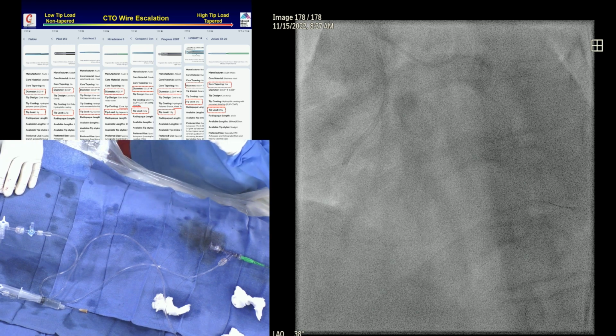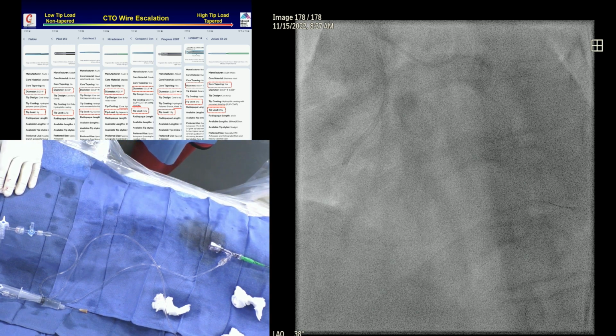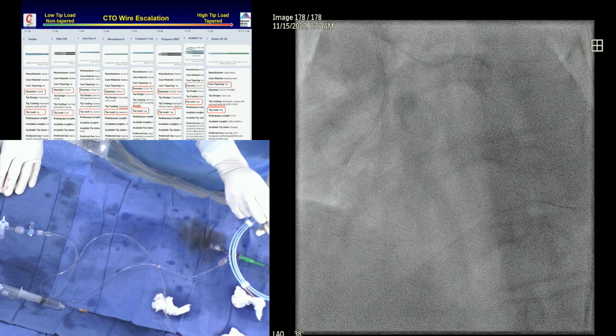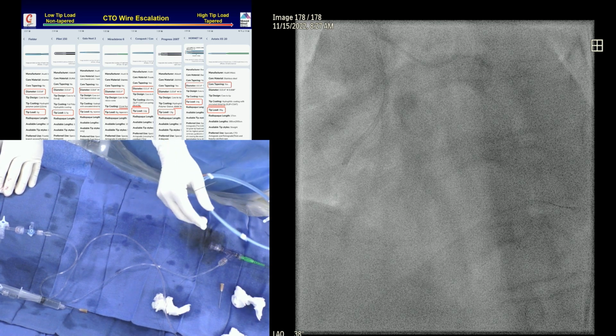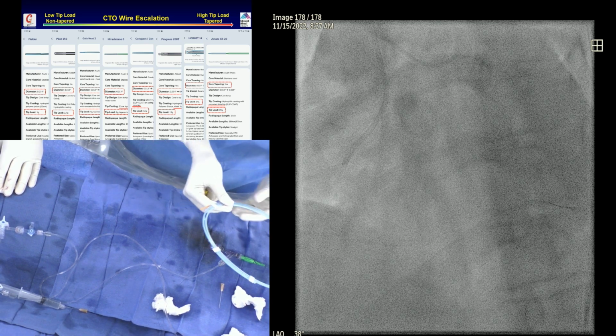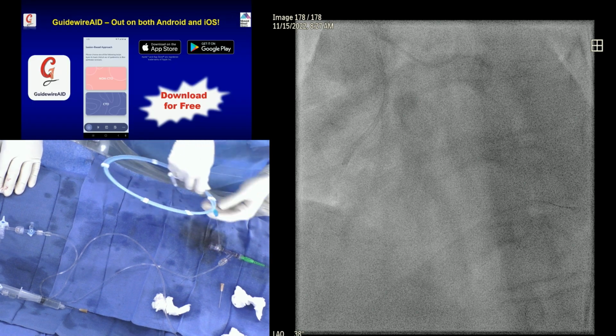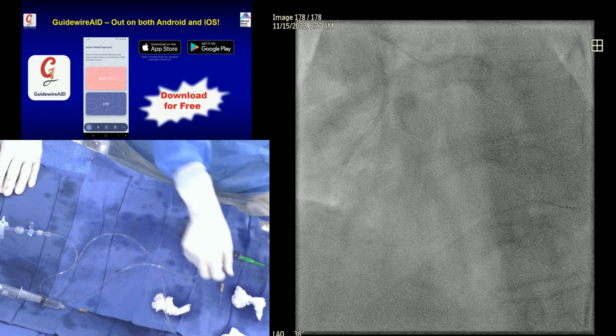So tell us what you are doing now. What ideally I would do is just place a stent before the bifurcation. No matter, it was a chronic lesion. You see the way the wire is behaving, like there is some calcium there, when I'm trying to wire with the Fielder. So I'm going to a run-through wire to go through that lesion.